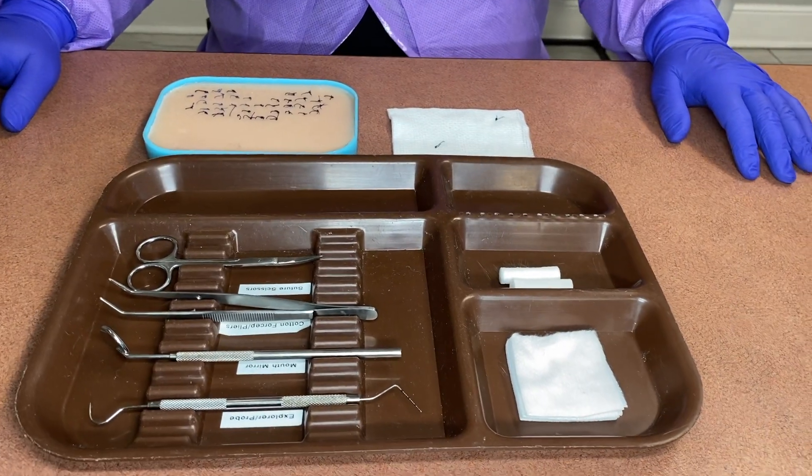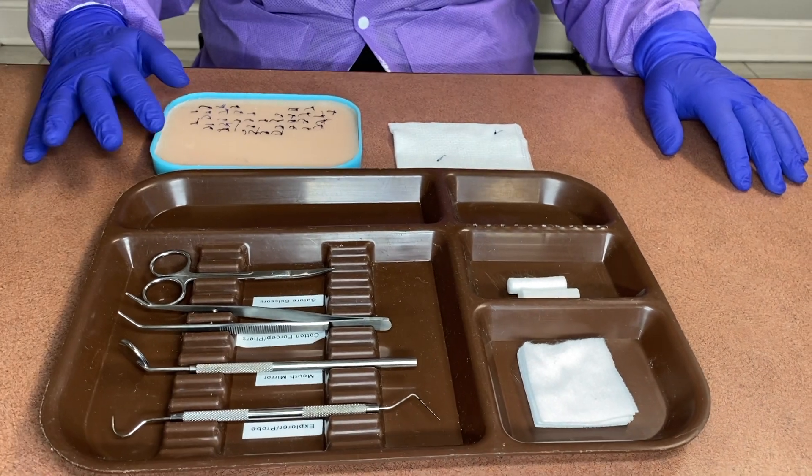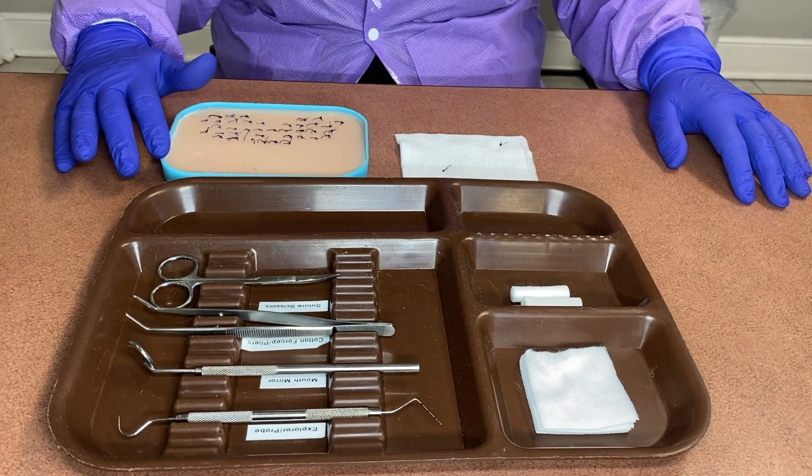Welcome back A4DA students. Today we are going to be explaining how to remove a suture. We'll go ahead and get started.